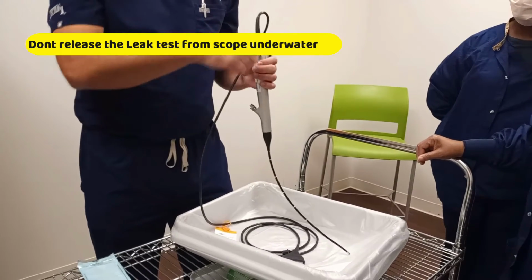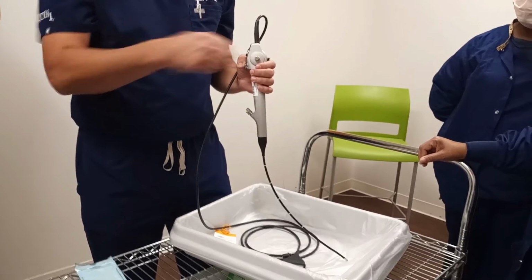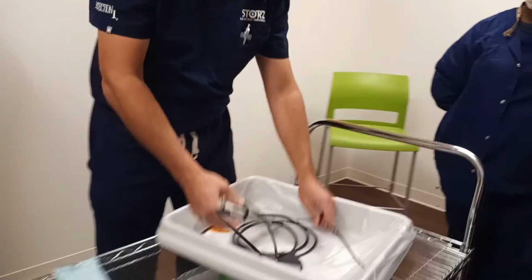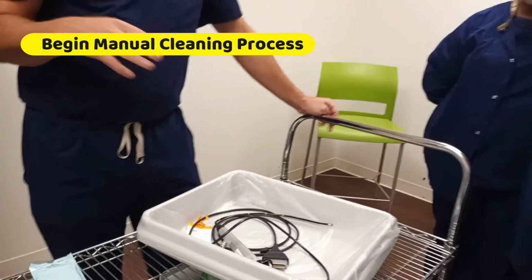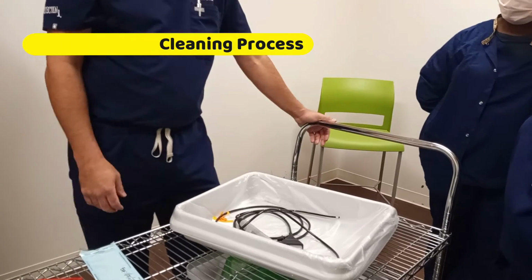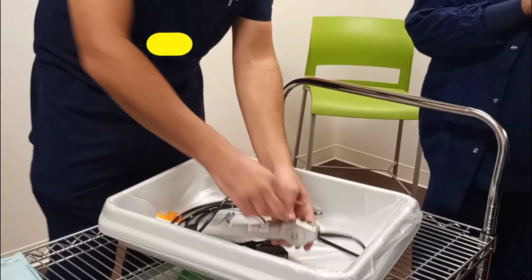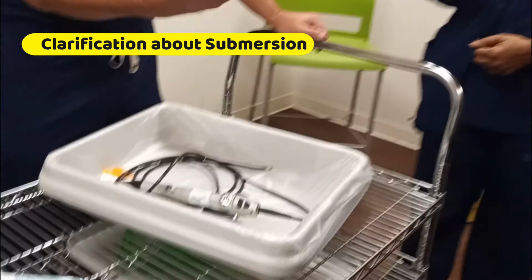Take the scope out of the water, depressurize the leak tester back down to 0, detach the leak tester, and then you're set to go with your manual cleaning, to where you can mix the appropriate mixture of enzymatic into the sink, and that way you have the correct mixture of soap to water. So you can dip this in the port in the water, but not the actual leak tester that you're holding.